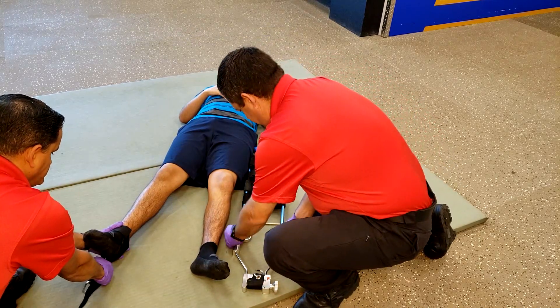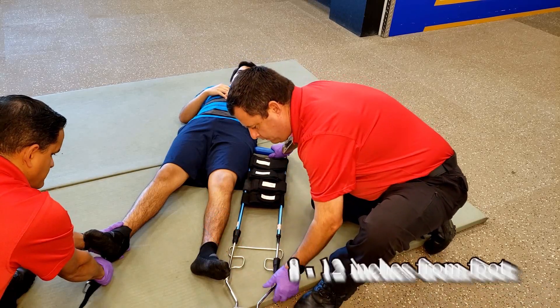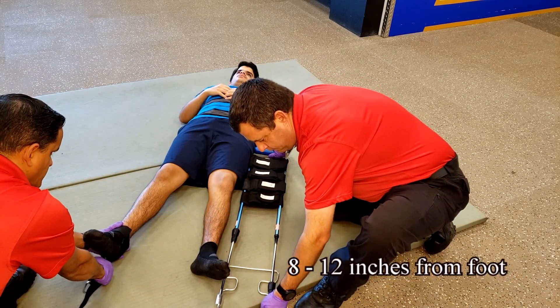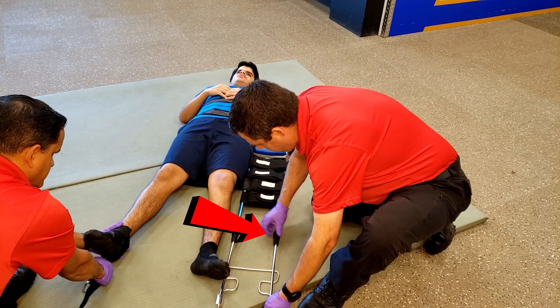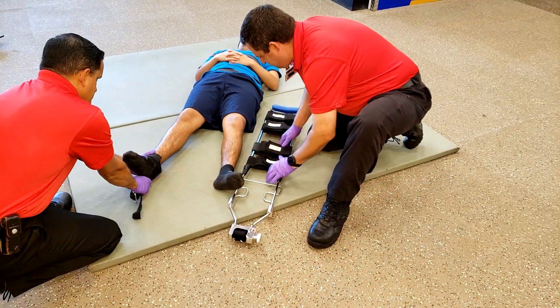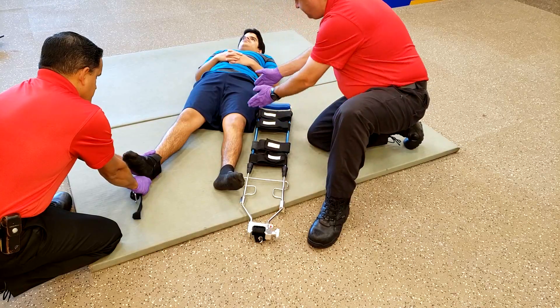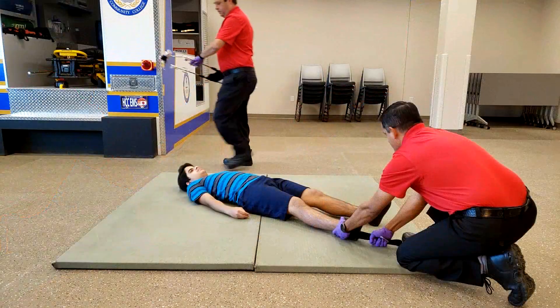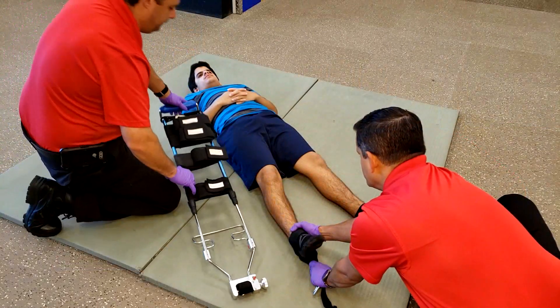Extend the traction splint so the mechanical winch is approximately 8 to 12 inches from the foot, then lock the traction splint in place. Verify that the straps are lined up where two are above and two are below the knee. Take the traction splint to the injured side and place it along the injured leg.